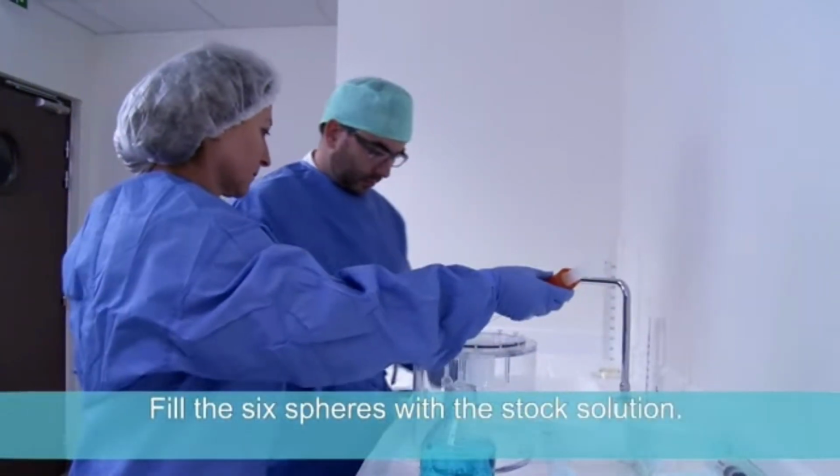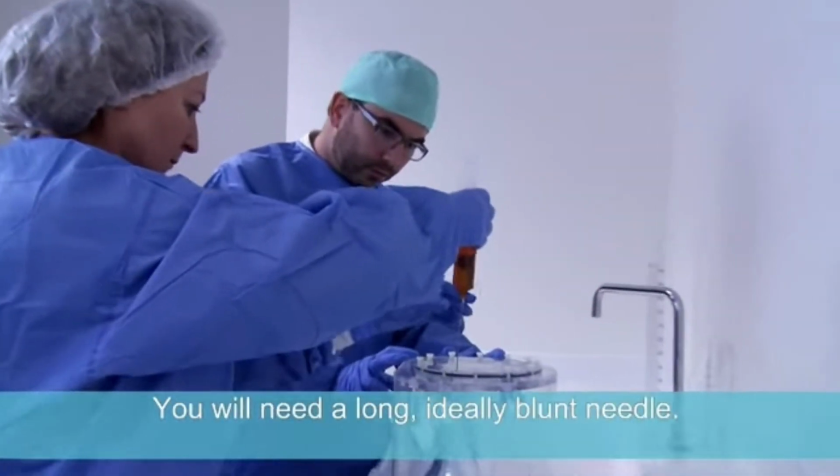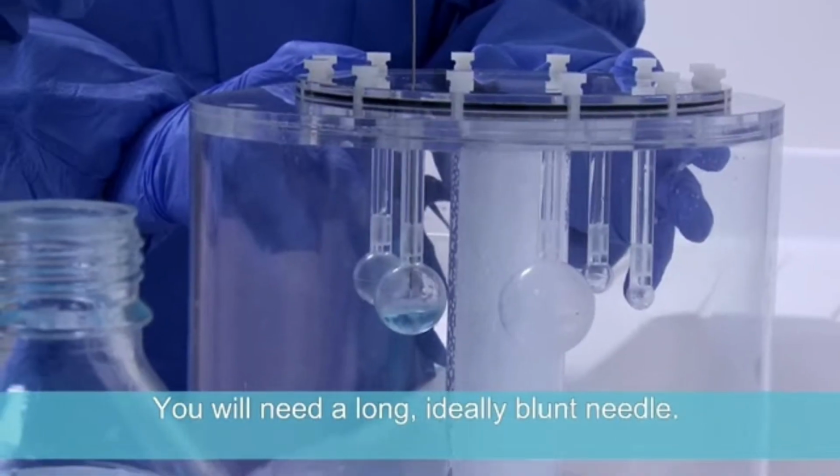Fill the 6 spheres with the stock solution. You will need a long, ideally blunt needle.